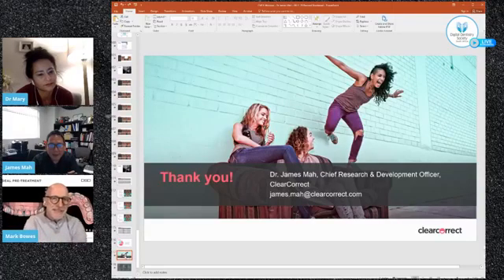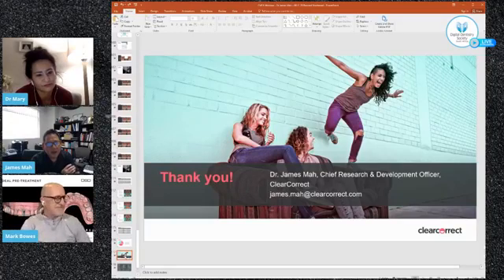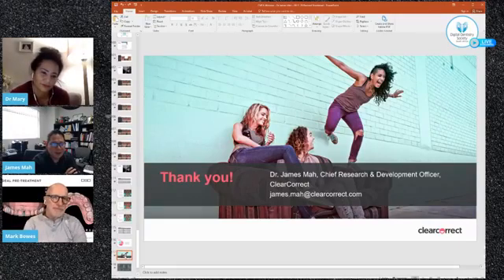Good or bad? Basically, I think they work by helping seat the aligners. There's everything from the light, the blue light, to others, and what they have in common is they serve to seat the aligners. So I think another way to do it is to prescribe the use of the chewies, or sometimes we give them the saliva ejector tip so they can work on that area to continue to seat the aligner. But so far, when you look overall at the literature on it, although there's sporadic reviews that there's some difference during a specific phase of tooth movement, overall, there hasn't been much of a difference.